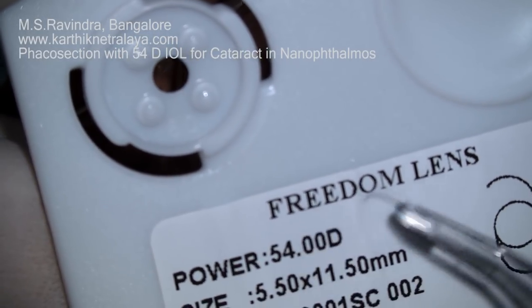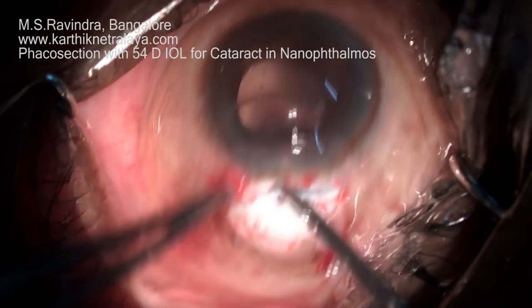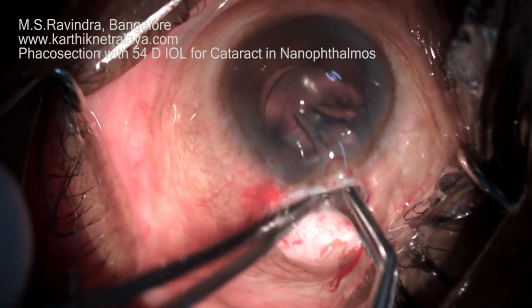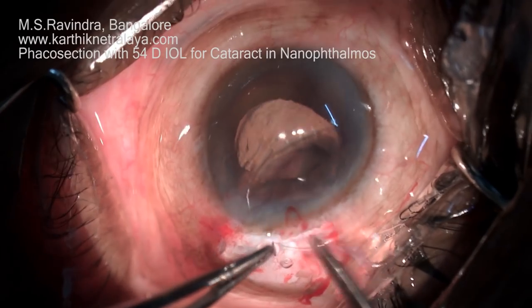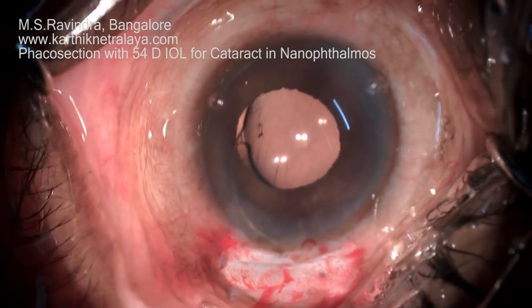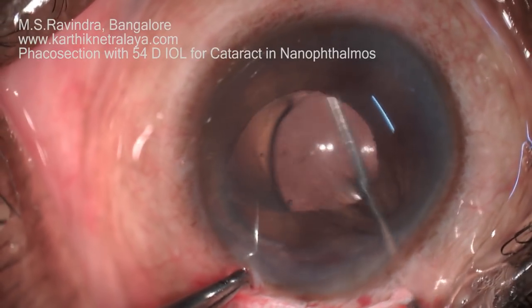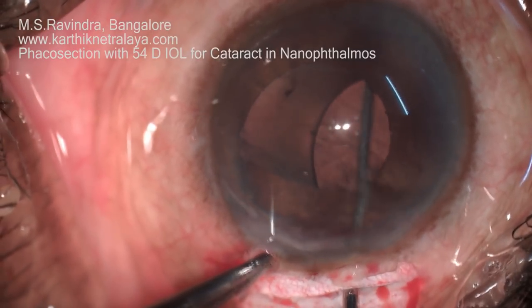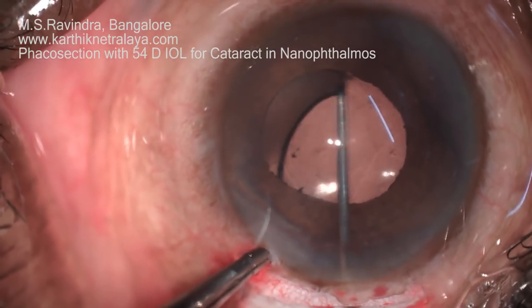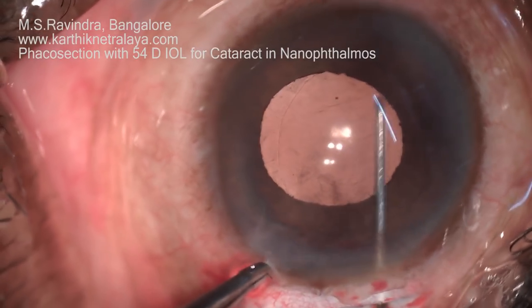This is a +54 diopter lens — it is very thick and is implanted as a rigid lens. It needs to go directly into the capsular bag in the first attempt; if it goes into the anterior chamber it is extremely difficult to rotate it back. The leading loop must go into the capsular bag first, and then the trailing loop can follow by rotation. The lens is now rotated into position and seated in the capsular bag — the ideal situation for a large lens like this.